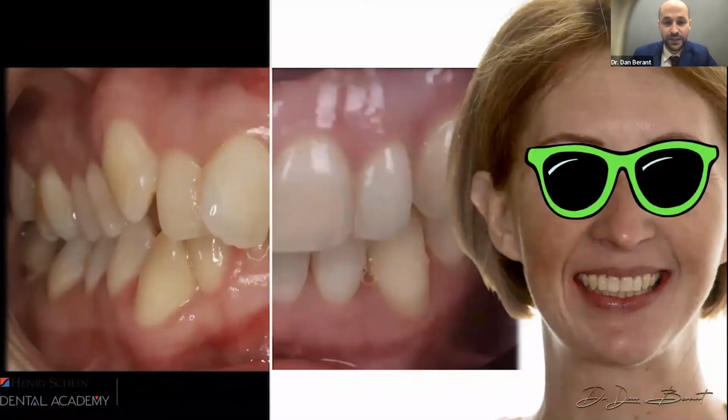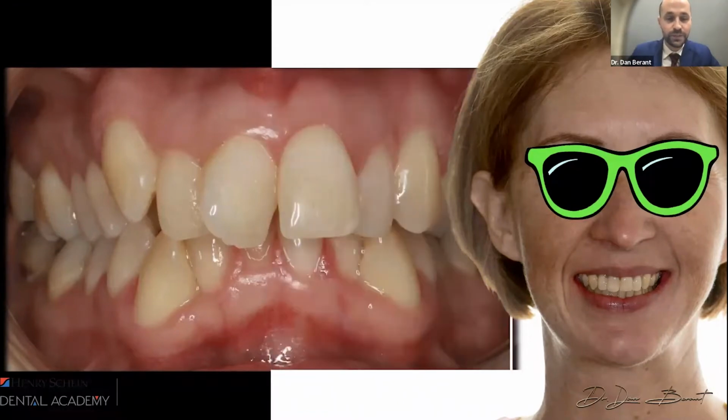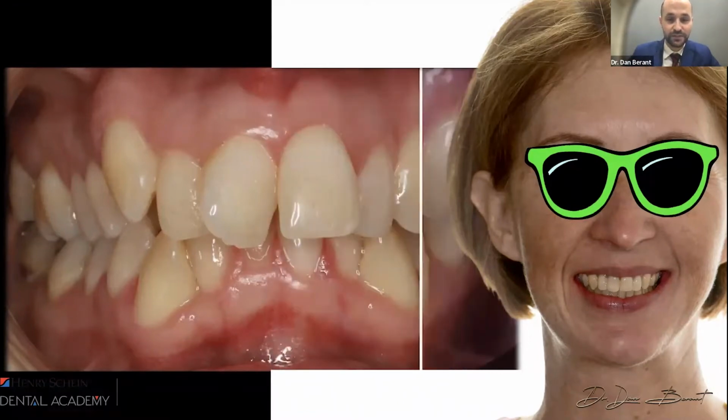And you can see that through the information we gained from the CBCT, which allowed us to diagnose the periodontal phenotype, which allowed us to see and diagnose that she's constricted in the transverse dimension. And we were able to use the CBCT also in our communication with the oral surgeon of how far we want her jaws to move forward. And then finally, make sure that all the orthodontic movement is done in a biologically sound manner.